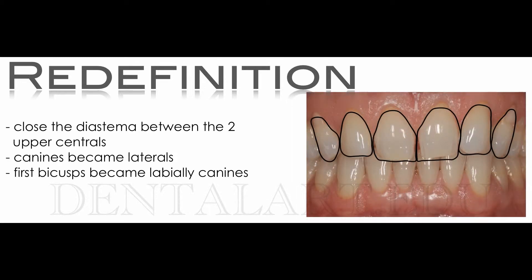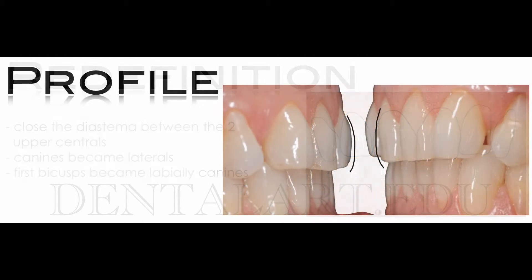We started with a virtual design, but the virtual design is only an indication because we have to stay in the anatomical configuration — especially if the patient doesn't need periodontal treatment. It's very important to stay in the anatomical configuration of the tooth because we have to move this configuration into the wax-up and the mock-up later.